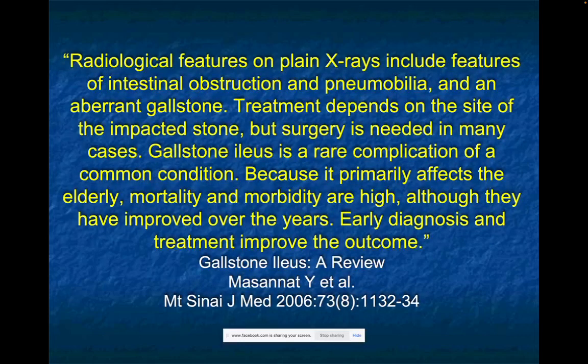If you remember, those who've been around the plain film days, when you were a resident, one of the things they quizzed you on is they gave you a plain film of the abdomen, there was air in the biliary tree, and then if you looked hard, you saw the gallstone in the terminal ileum. Great case, can save the patient's life by making the diagnosis.